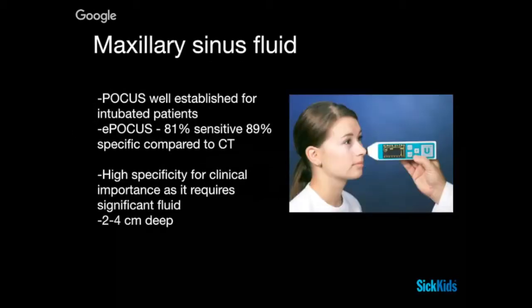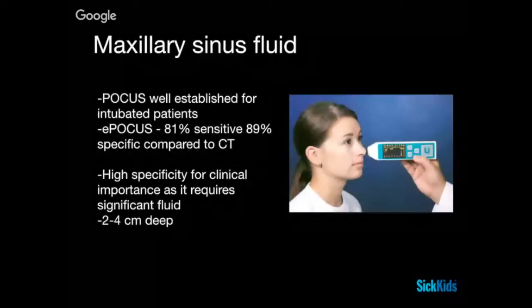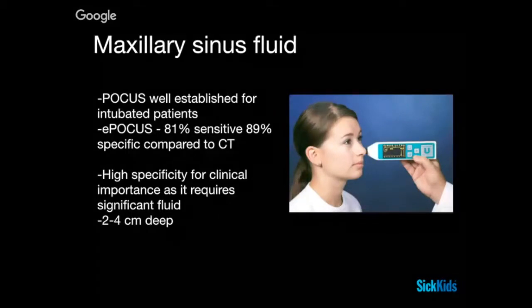So when we think about sinus fluid, we know that ultrasound is well established in assessing for sinus fluid in intubated patients. In emergency point of care ultrasound, there are pretty good sensitivities and specificities compared to CT for assessment of these areas of the face. There's a high specificity for clinical importance because clinically important sinusitis requires significant fluid.